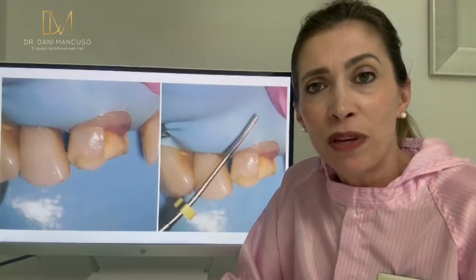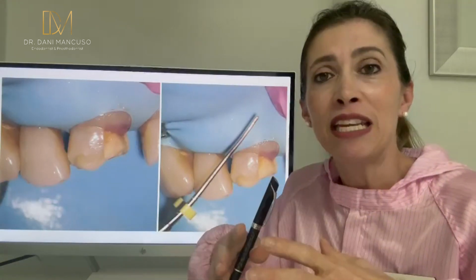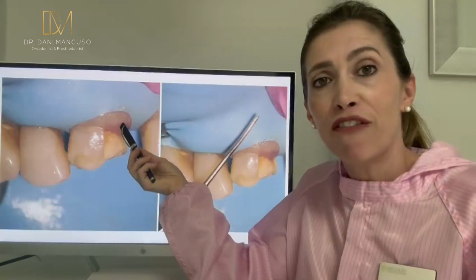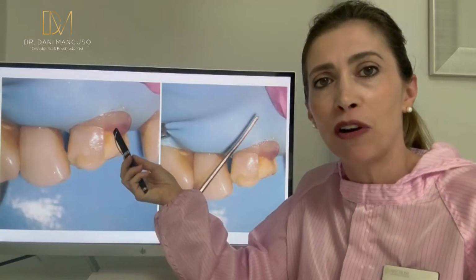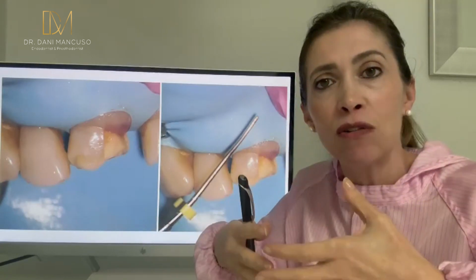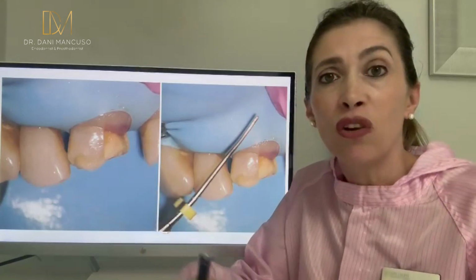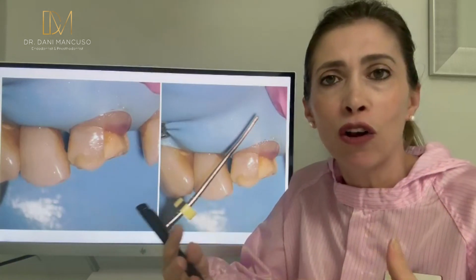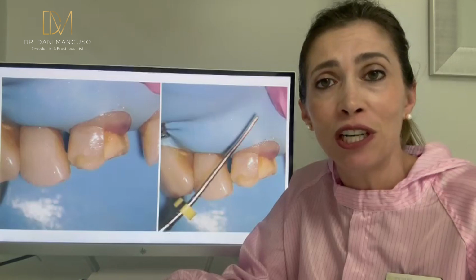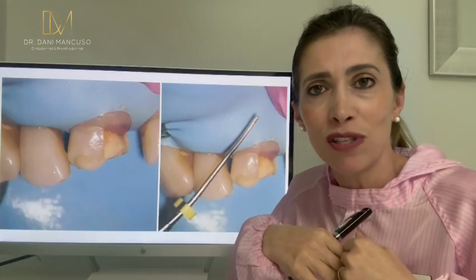Remember I said that we are not adjusting the tooth, grinding that tooth down. We need to build it up. Well, there was a fracture on that central with a little bit of granulation tissue, and I need to prepare that and build up with a composite. It doesn't need to be perfect, but what you don't want is lots of gingival inflammation after you build up. So remember the hot tip I used on the previous episode?